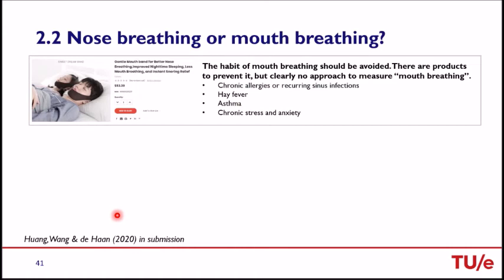And then the other measurement we think about is nose breathing versus mouth breathing classification, because we need to prevent the habit of mouth breathing. There are actually already some products for preventing it, but clearly there's no approach to measure mouth breathing. And mouth breathing has many drawbacks and harms our health, for example chronic allergies, hay fever, asthma, chronic stress and anxiety.